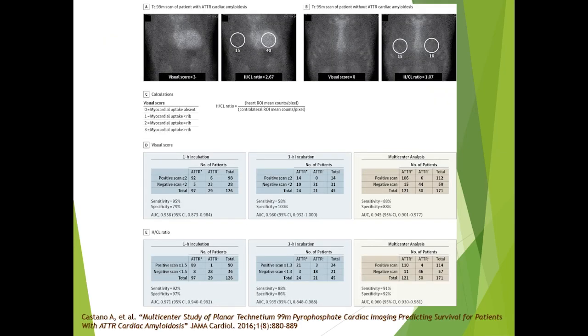This is the study that showed that looking at not only visual score but heart to contralateral chest ratio, the overall performance was similar whether it's 1 hour incubation or 3 hour incubation.